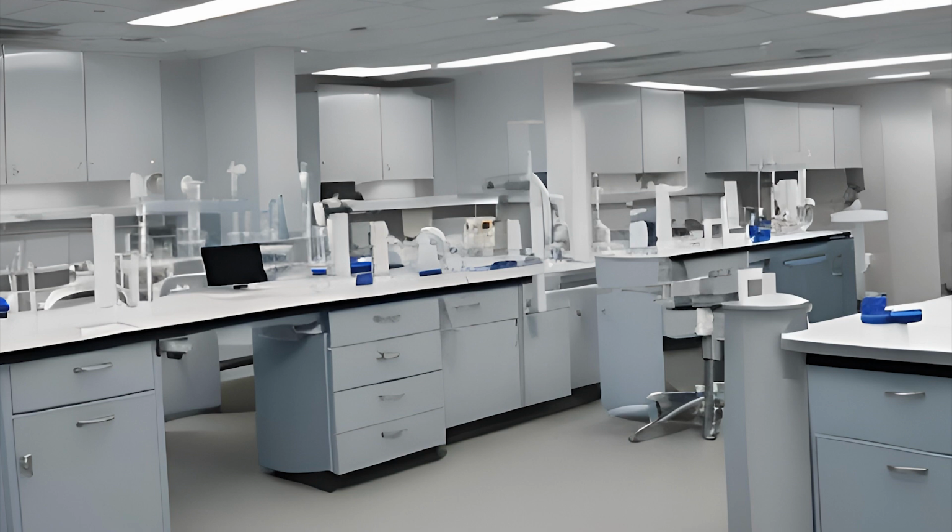Some of the possible errors that you might see before collection are an inadequately prepared patient. Either they're dehydrated, so it's hard to find their veins, or they're not fasting. They could be on different treatments like an intravenous medication or radioisotopes. The physician could have put in the wrong test, or they might not have ordered every test that they wanted.